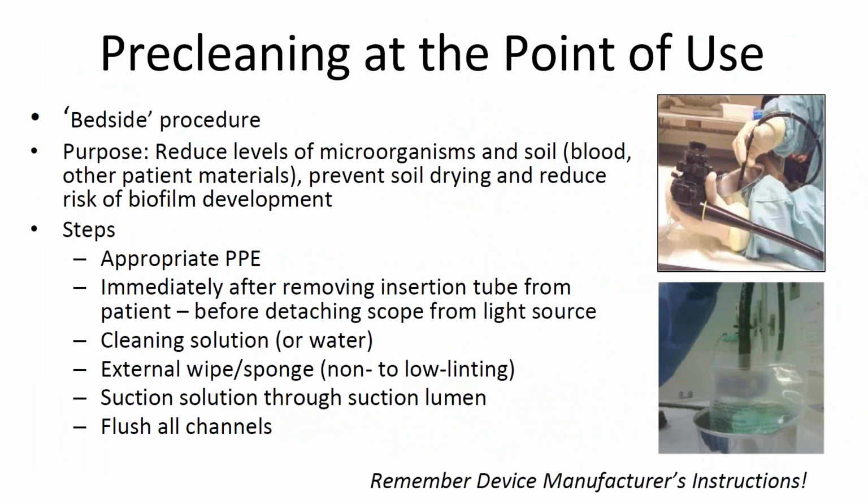Now we're going to look at some best practices as mentioned in ST91. Again, this is just some of the information that's available in ST91. We'll start with pre-cleaning. Pre-cleaning is the procedure that initiates the cleaning process, and it's performed at bedside immediately after removal of the endoscope from the patient. So again, we're still in the patient room at this point.